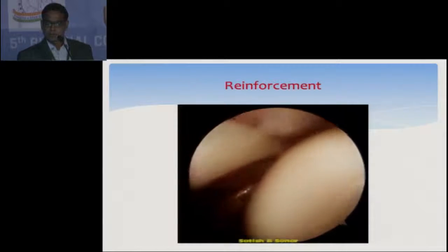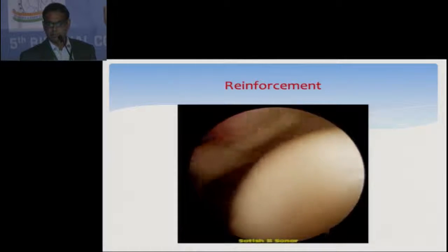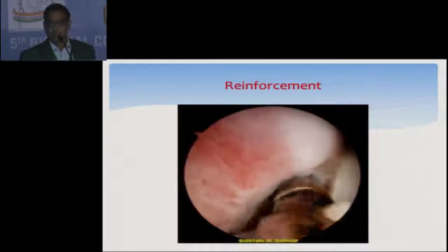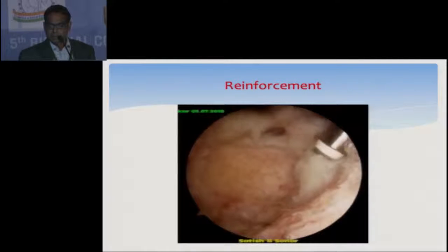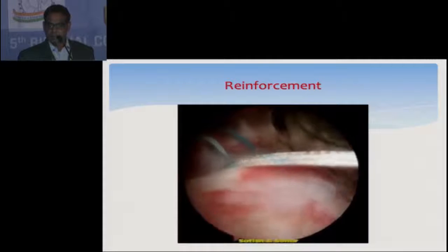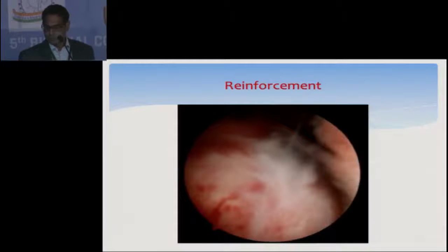This is another case. From the inside you cannot see anything other than the frayed area. I release the biceps in the rotator interval all around so that it can be easily pulled into the subacromial space. This is the acromioplasty, then lateral clavicle resection and AC joint resection. I divided the torn area — I didn't make the tear complete — passed the anchor and sutures, with one suture passed through the biceps. Then the biceps is repaired over that acromial side cuff tear.